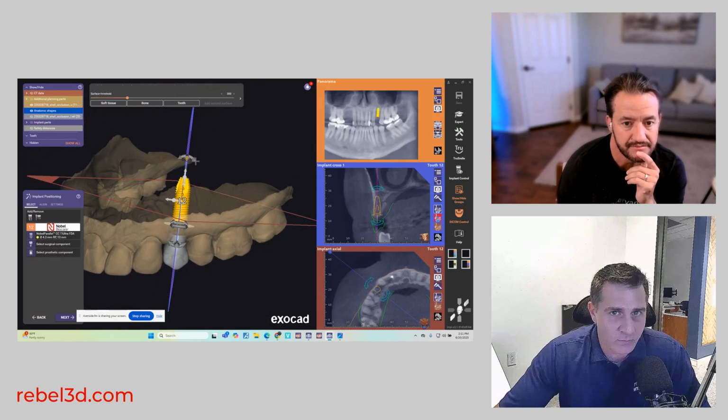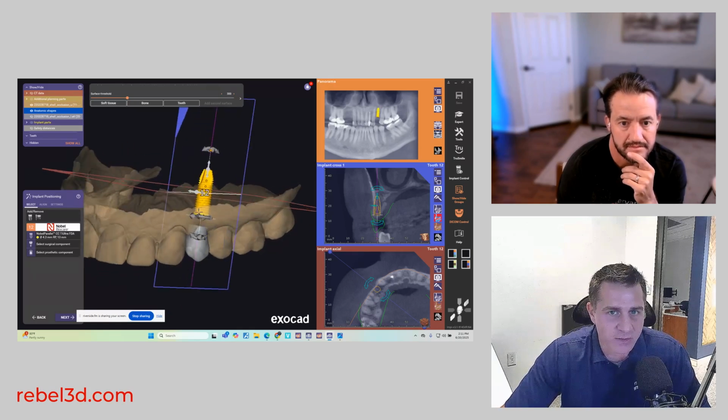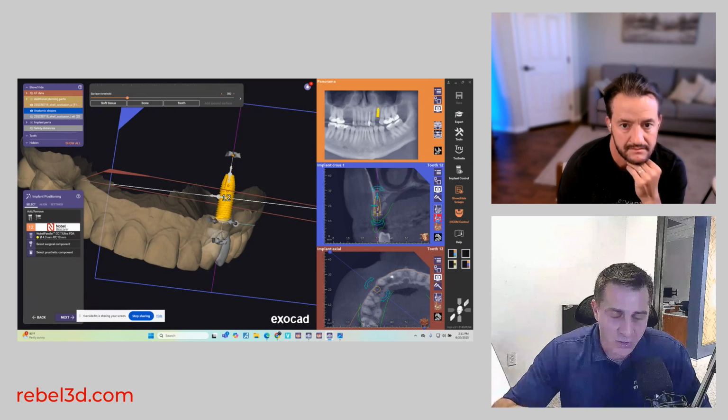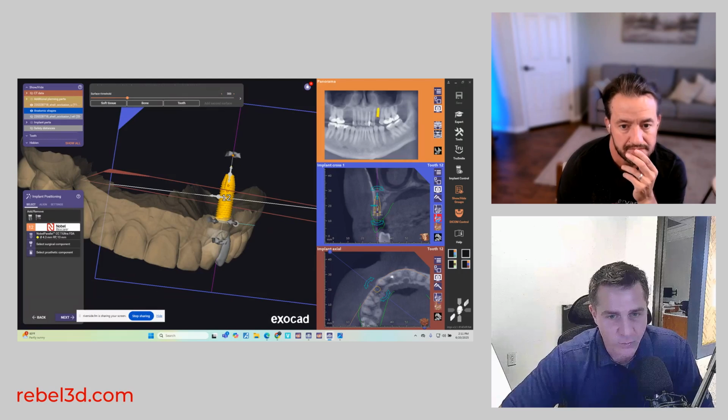Before I place the implant and after I've completed the osteotomy, there's a burr you use to open up the coronal aspect of the crest of the bone, and then we'll place the implant. I flap. I don't do a hole punch on these cases. I'll start with the first drill without flapping, and then I'll take the guide off and visualize it.